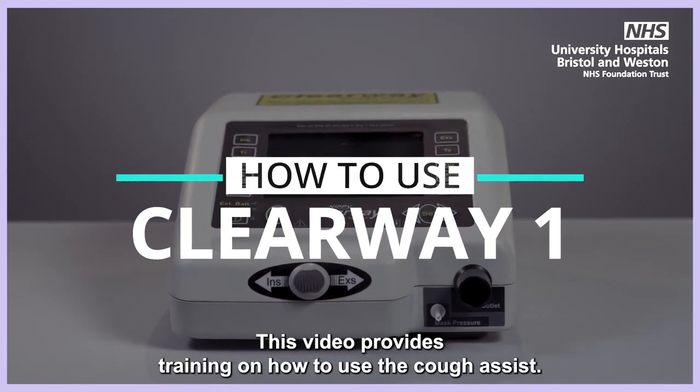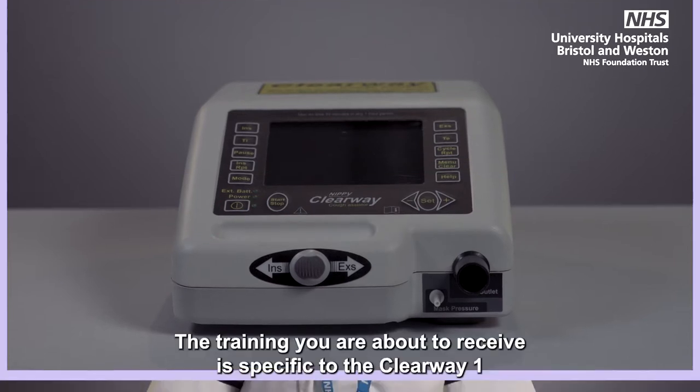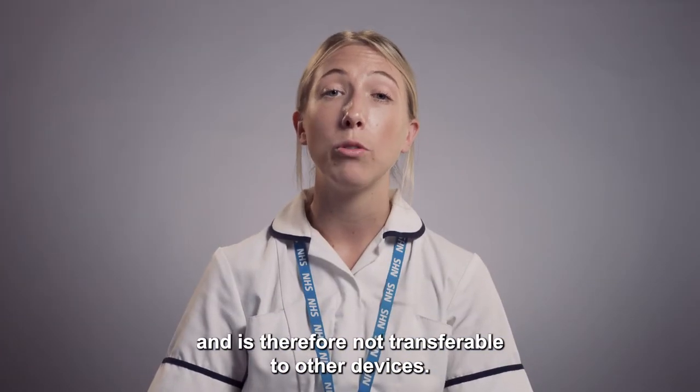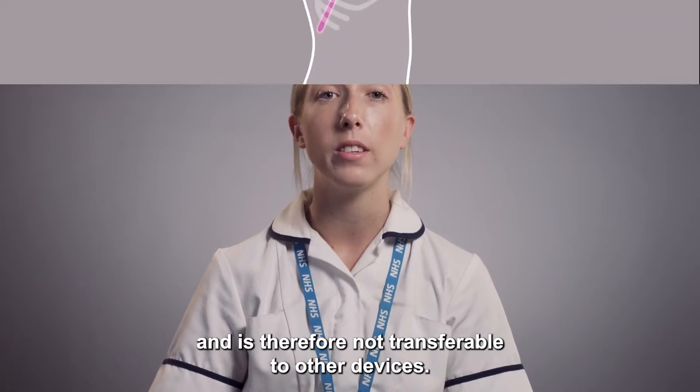This video provides training on how to use the Cough Assist. The training you're about to receive is specific to the Clearway One and is therefore not transferable to other devices.